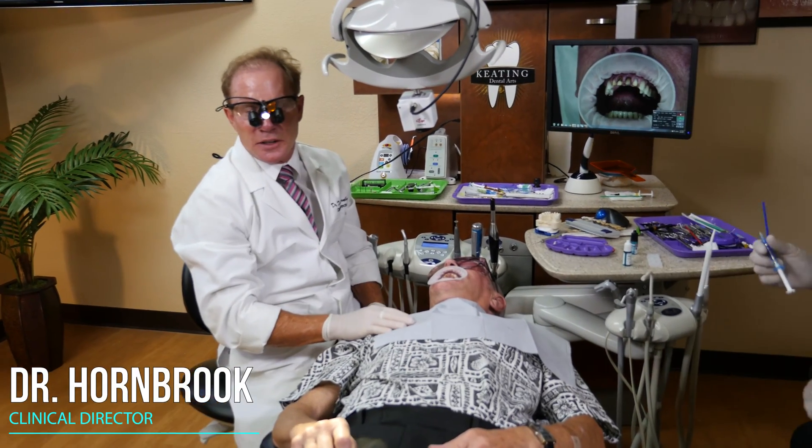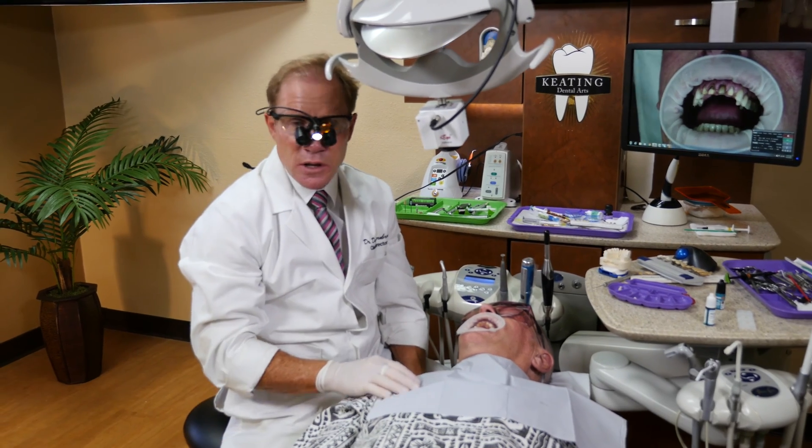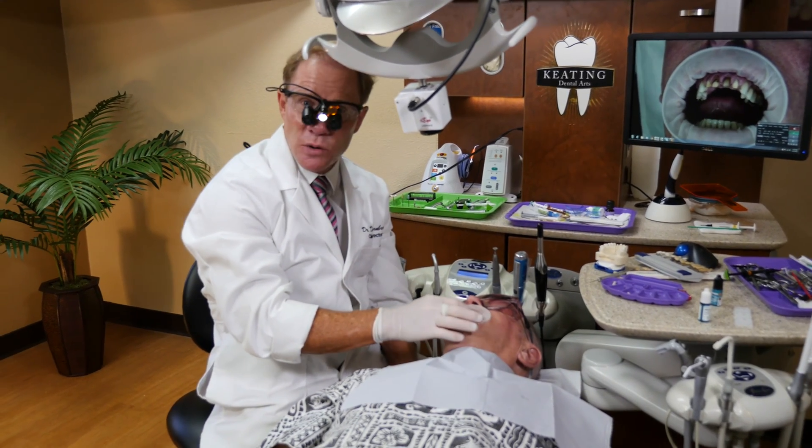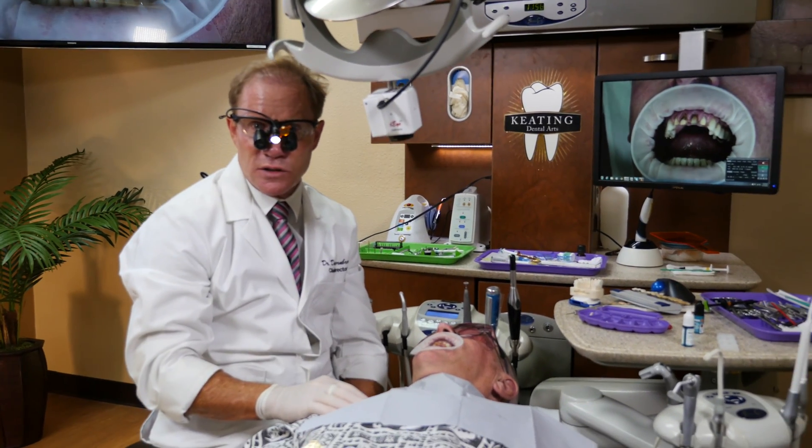Hello, I'm Dr. David Hornbrook, Clinical Director of Education here at Keating Dental Arts. And today we're going to insert four of our new KDZ aesthetic monolithic zirconia restorations.